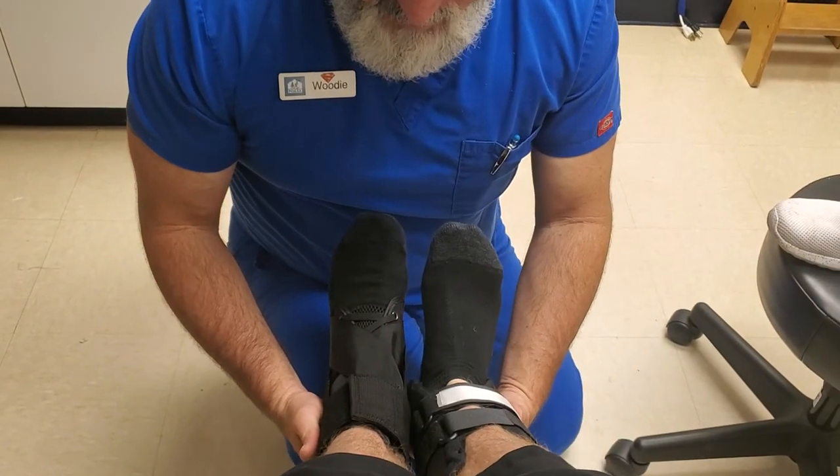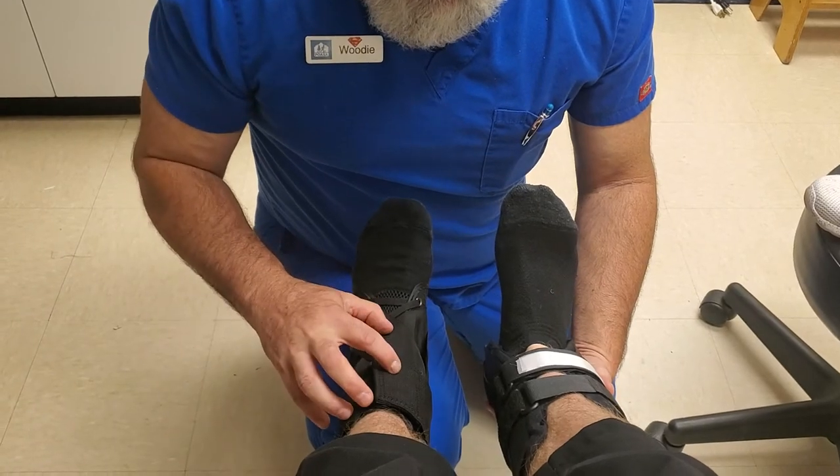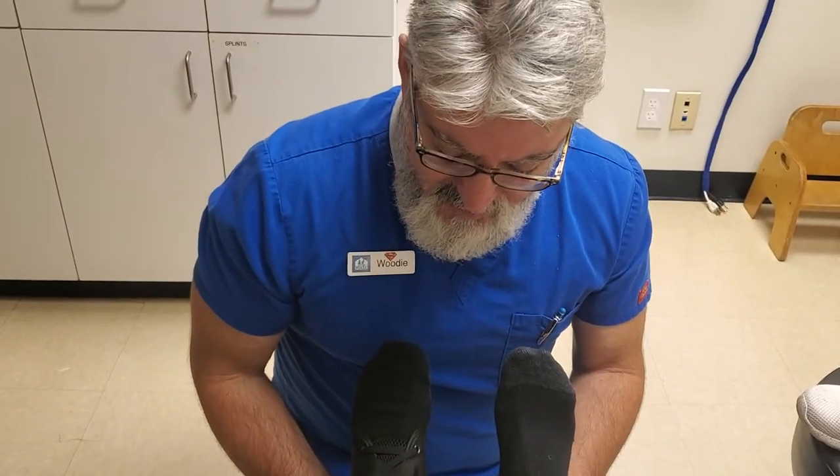These are your two ankle braces — the most common ones placed on: the stirrup ankle brace and the lace-up ankle brace. That is all for this video. If you guys have any other things you want to talk about or have videos made of, let us know in the comments. Have a good day. Thanks.